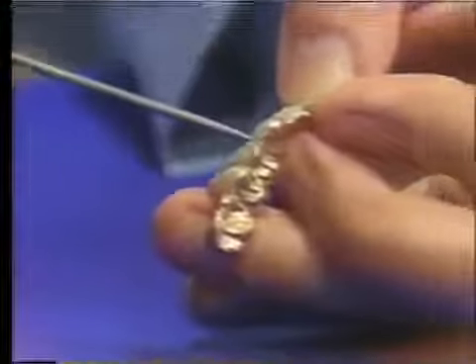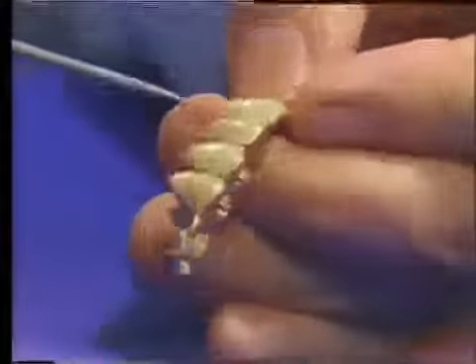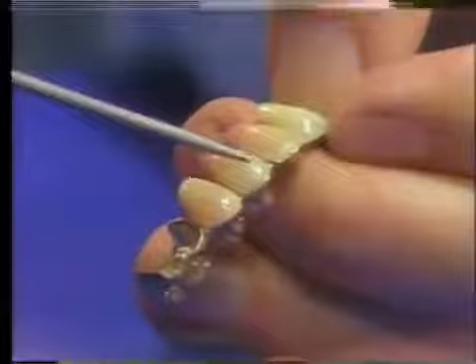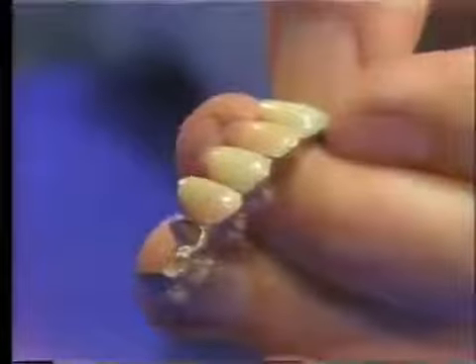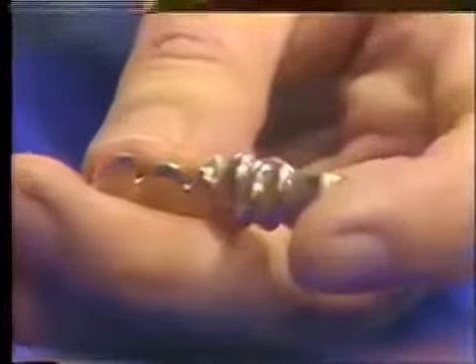You can see, I think, along the labial boundary here that the gold is just visible on the labial surface and protects that porcelain. The fitting end of this has been adapted to give the ridge lap adaptation of this part of the porcelain and gold to the tissue.